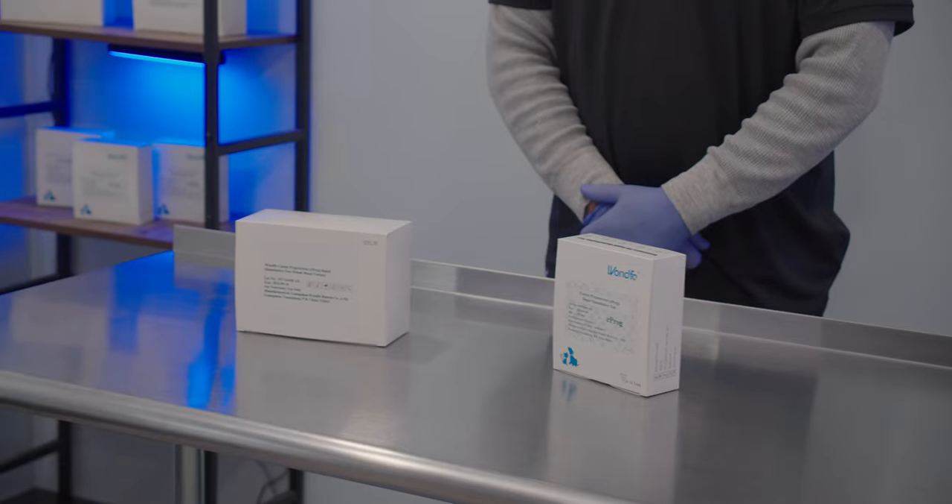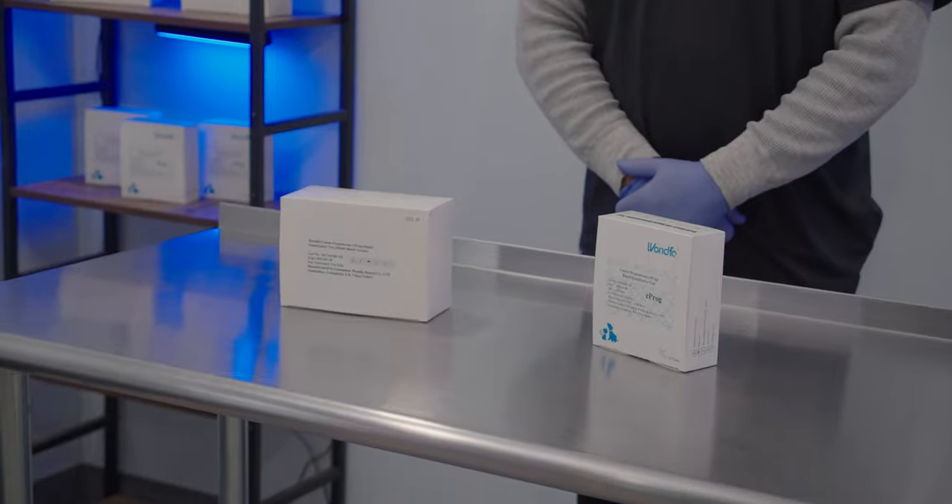You can expect the same level of accuracy and reliability out of either the serum or the whole blood run tests. Which test is best for you? There are a few key points to note.